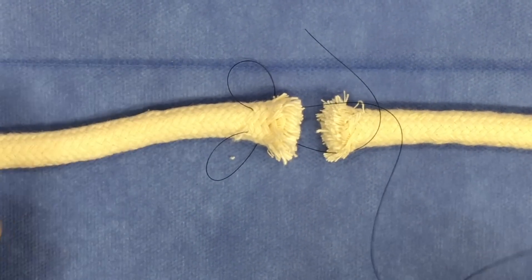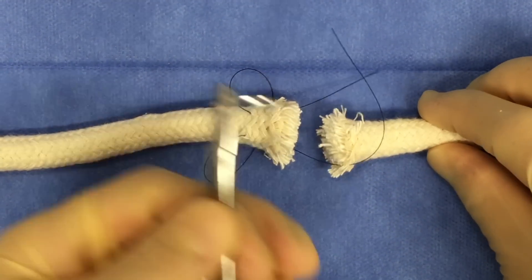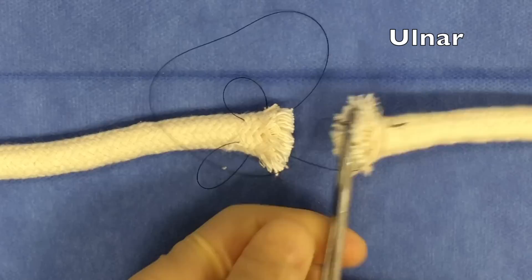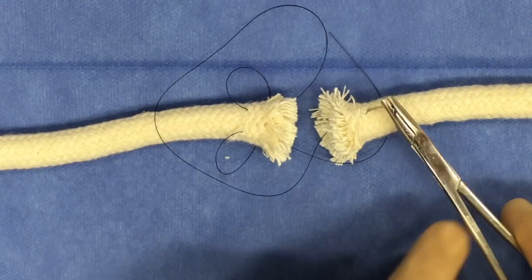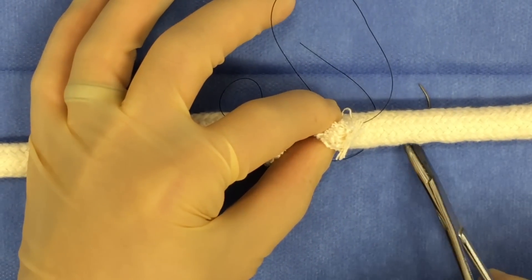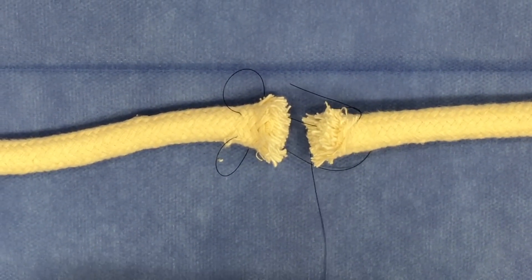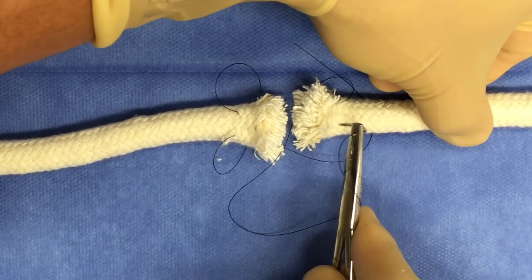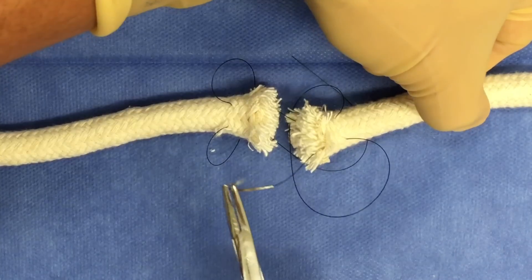You're now going to suture going through the dorsal aspect of the tendon. If you started on the radial side, you're now going to go more to the ulnar side and vice versa, suturing exiting out of the lacerated or cut end of the tendon. When done appropriately, you're going to start to develop this variation of a horizontal mattress suture pattern. Your next throws will focus on the other end of the lacerated tendon — again going intratendinous through the lacerated end. You'll exit on the dorsal aspect, loop the suture behind the tendon, then enter again through the dorsal surface, exiting through the cut end of the tendon, such that you develop this butterfly-type pattern which will cinch down once you tie the knot.